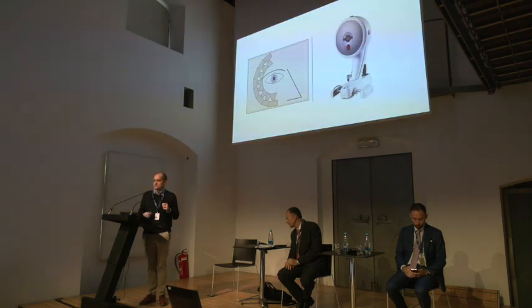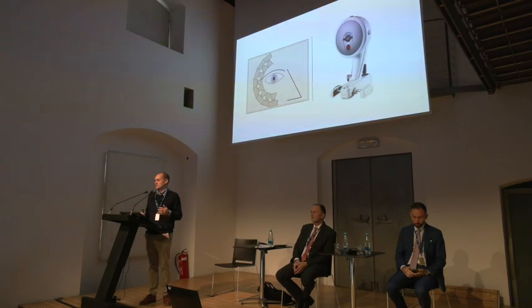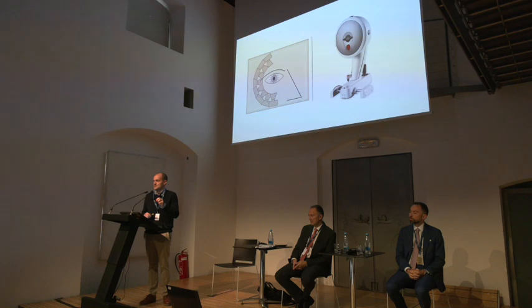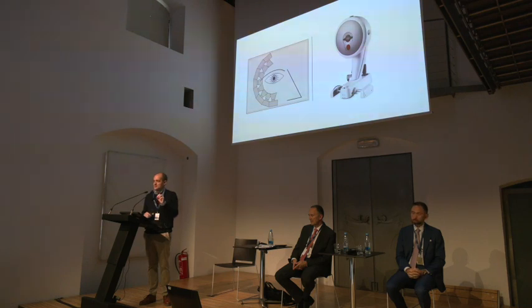What's the problem with Scheimpflug? The standard scan on Pentacam is 25 slices. The 25 slices take about 1.5 seconds to complete. Now, we've already seen that light scatter can affect it a lot, but think about the time. 1.5 seconds. If someone has nystagmus, or if they're moving their eye, or if they're looking just a tiny bit off center, you can get really crazy data points which make no sense.